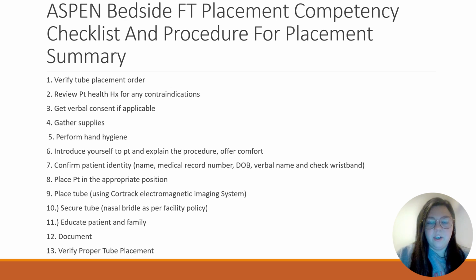When placing a feeding tube, it's important to follow the protocols of the facility that you're in. One way to ensure that you're placing a feeding tube correctly is to use a checklist such as the ASPEN Bedside Feeding Tube Placement Competency Checklist. This checklist is a general checklist for tube placement feedings.